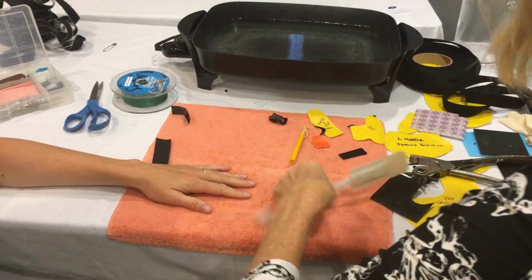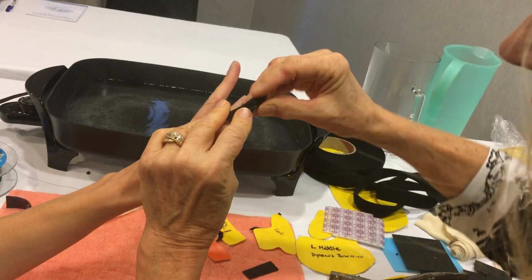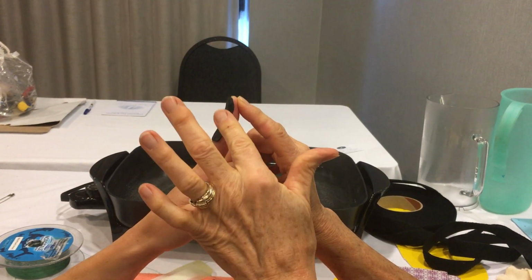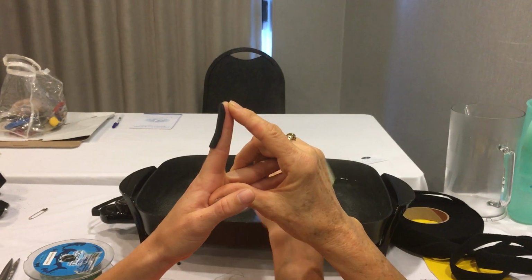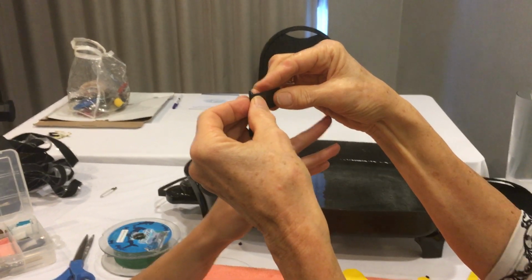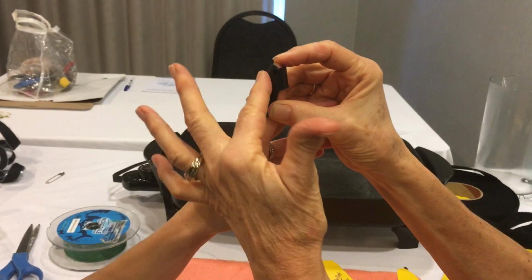So with this one, we're going to just run a dorsal piece from the PIP joint to the tip of the finger. And as this is hardening, I'm holding the distal phalanx in slight hyperextension. They say you don't want so much that the skin blanches, but enough so that those tendon ends can reapproximate. And then once that hardens, you take a second piece of thermoplastic and run it underneath the distal phalanx and secure it to the dorsal piece. Again, I might use my heat gun to heat that and seal it permanently.